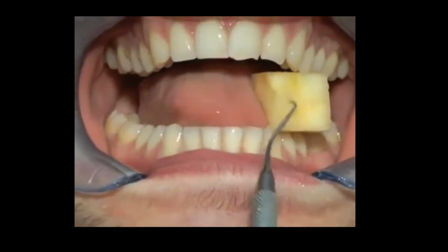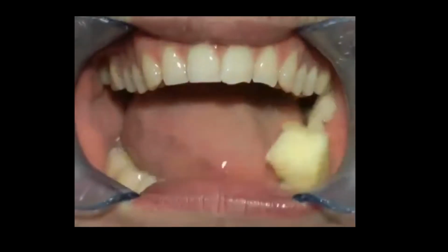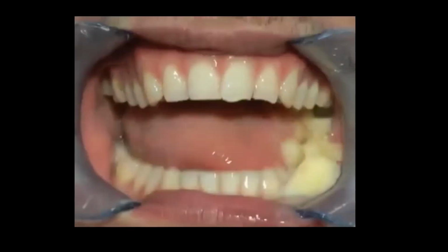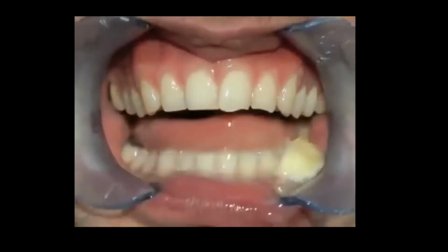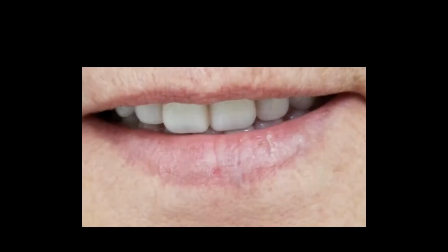This last video I just want to show you quickly: look at the cycle of this person. What do you see different? See how it's more vertical? It's not as teardrop as the other person. See? So the teeth function within a chew cycle. That's the big thing here, that teeth function within a chew cycle. And we don't pay attention to that. We didn't learn to diagnose that or pay attention to that in school, and no one taught us. I'm here to challenge that now and say the teeth have to work within that chew cycle. And we missed that on an articulator.